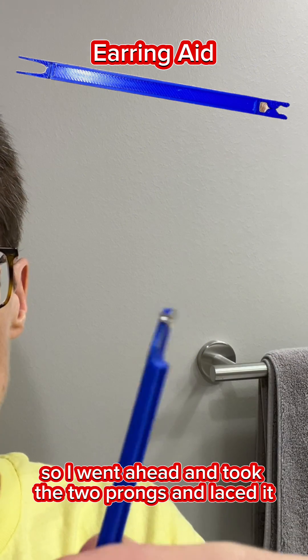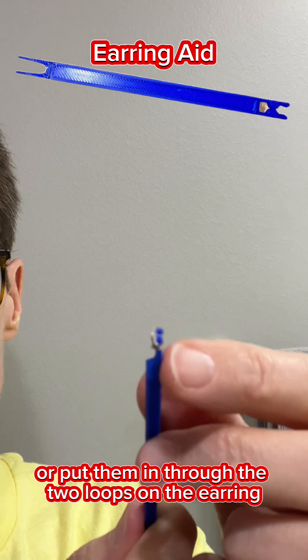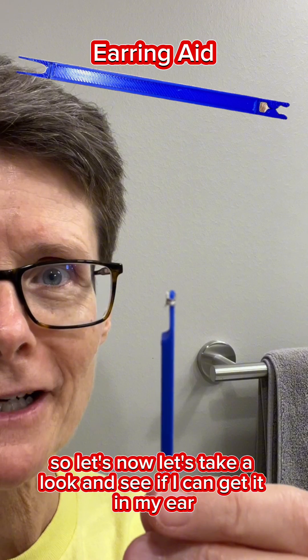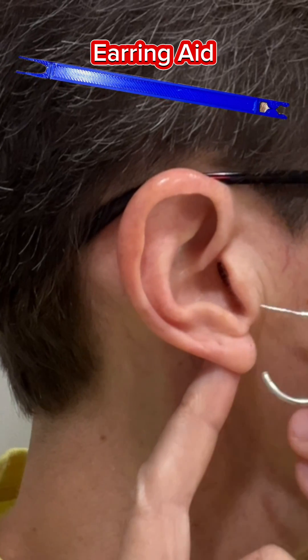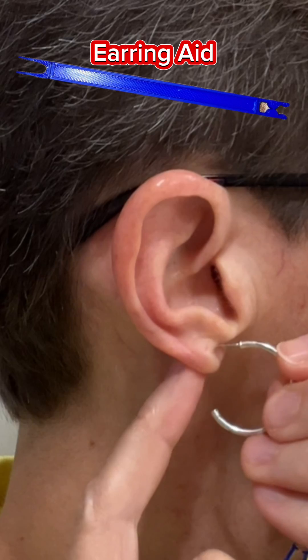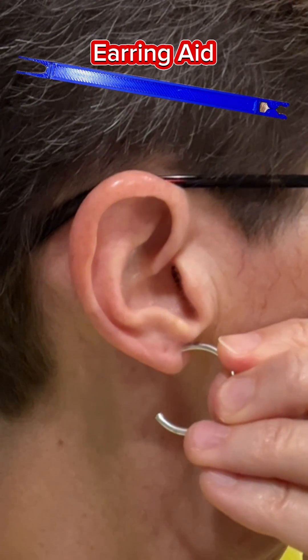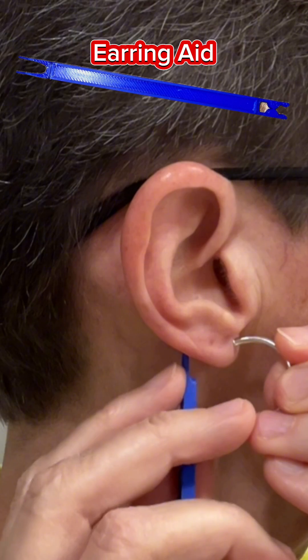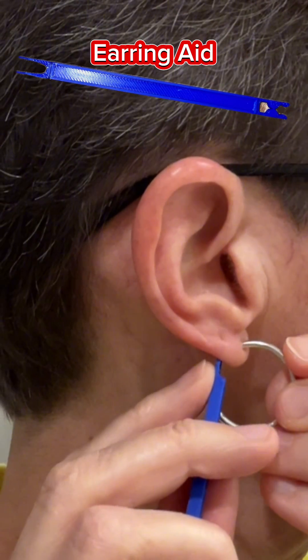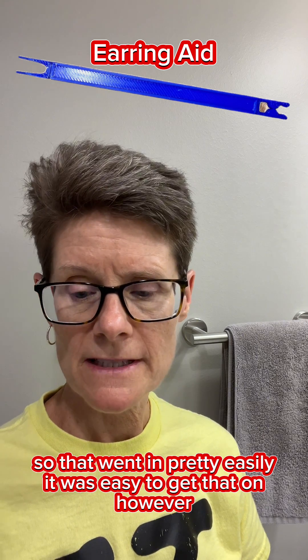I went ahead and took the two prongs and put them through the two loops on the earring. Let's see if I can get it in my ear and see how that goes. So that went in pretty easily — it was easy to get on.